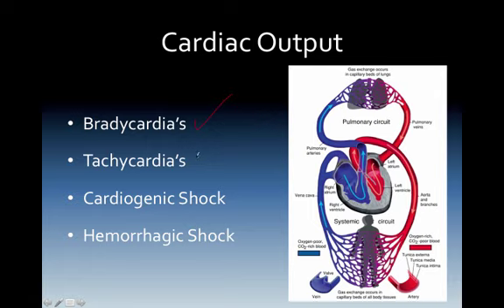So tachycardias, are they tolerating it well or are they not? In cardiogenic shock, are they going into pump failure or not? And in hemorrhagic shock, are my fluid boluses effective or not?